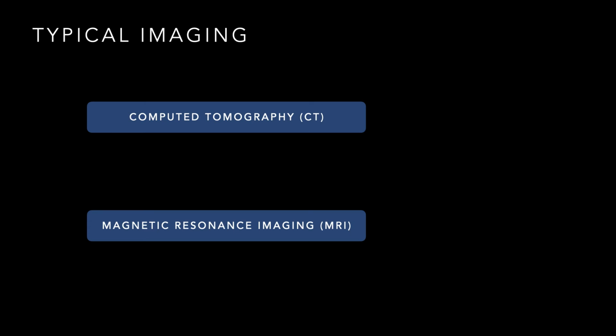And this is probably the bigger role for the MRI: okay, we tried conservative therapy, and this will be for your orthopedists, things aren't getting better. Now let's MRI this thing and see where we're at in terms of, do we have an encapsulation? Do we need to get in there? How big is this thing? How far does it extend? So it may be more of a follow-up and operative planning imaging modality, as opposed to straight out of the ED. It's probably not going to throw a lot of people in the MRI machine just to make the diagnosis when I didn't know it was there to begin with, right? So that's your typical imaging modalities.